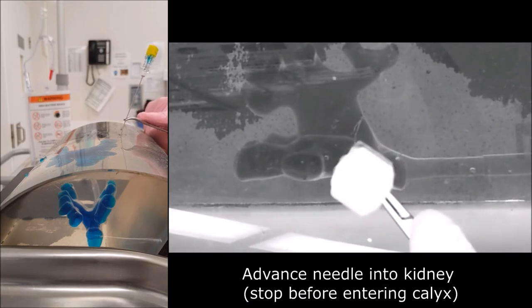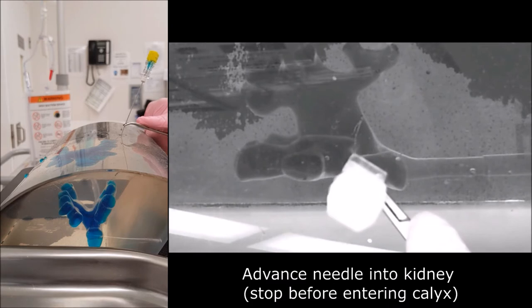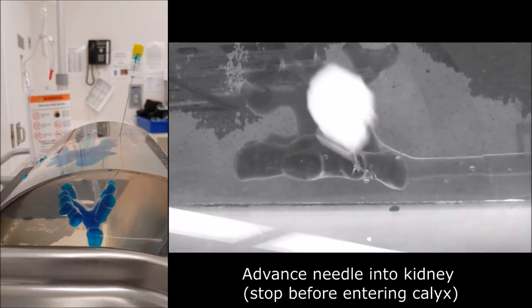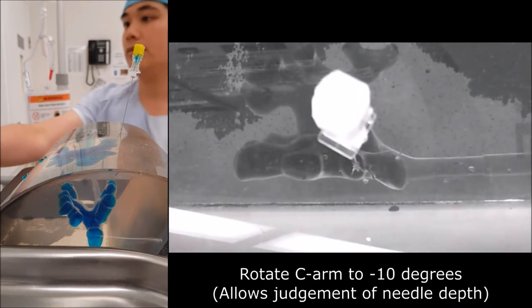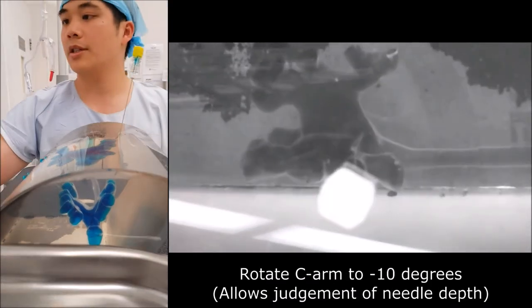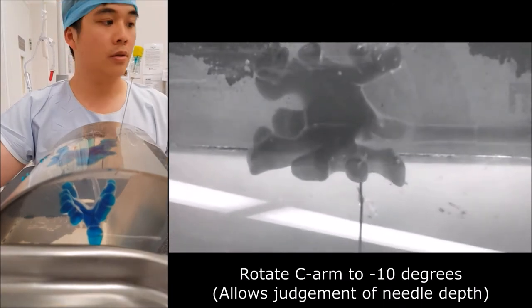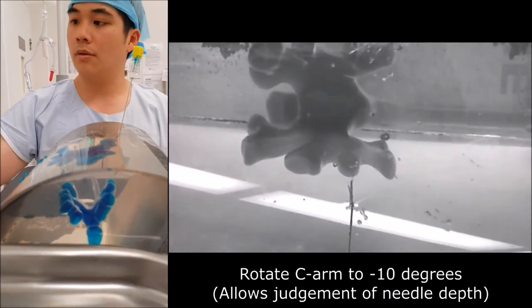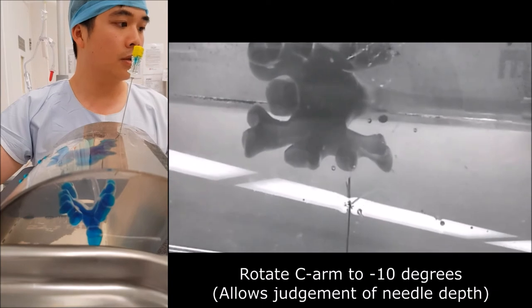Advance the needle into the kidney, but stop before entering the calyx and confirm it is in position by watching the needle move with respiration. Rotate the C-arm to minus 10 degrees, and this allows judgement of the needle depth along its tract.